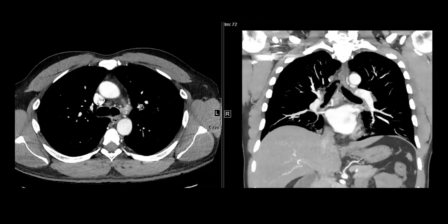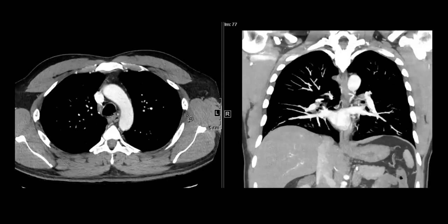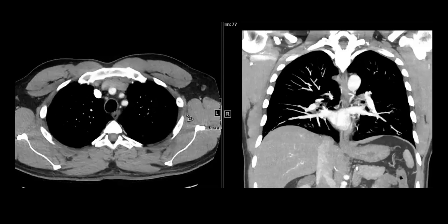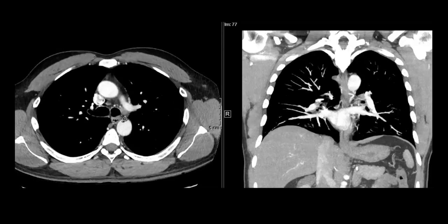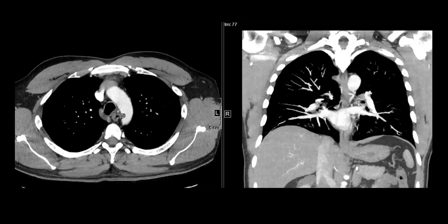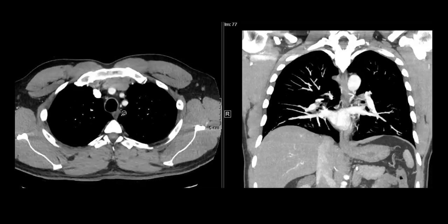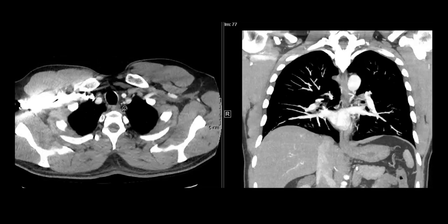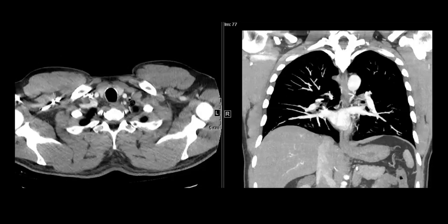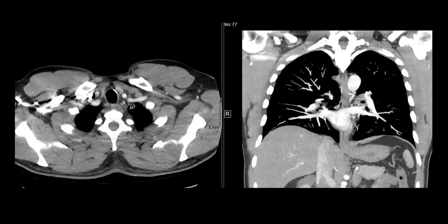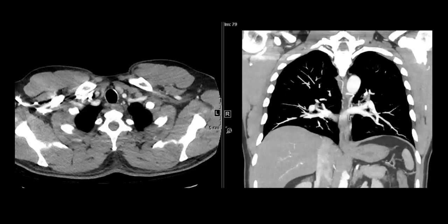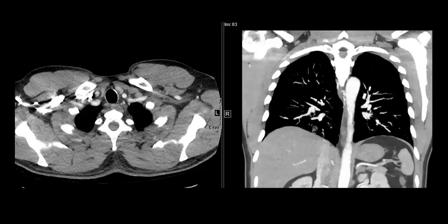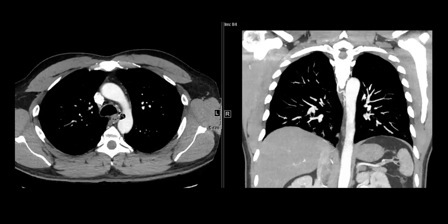On the MIP images, apart from the bronchial artery dilatation — hypertrophy of bronchial arteries — there is another interesting finding I missed completely. This artery is going into one of the lungs, and superiorly if I trace it, it is not draining into the aorta — it drains into the subclavian artery, the left subclavian artery. These are known as non-bronchial systemic arteries, and it has implications in management.